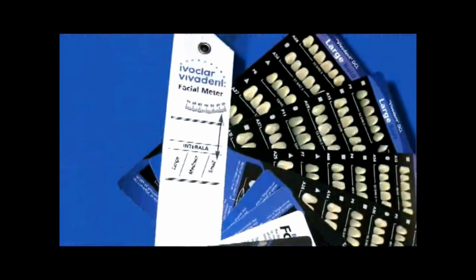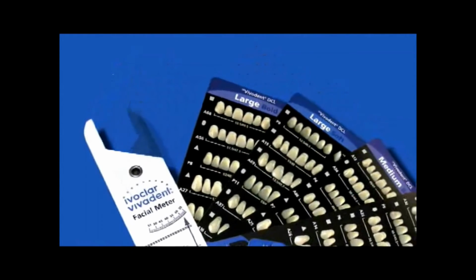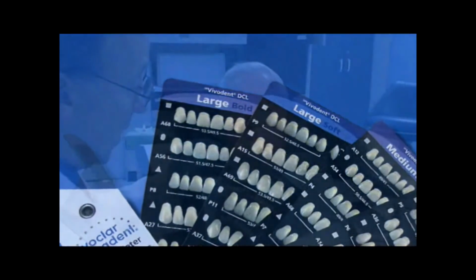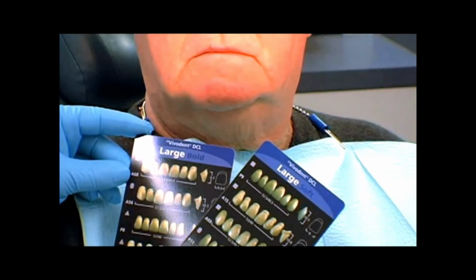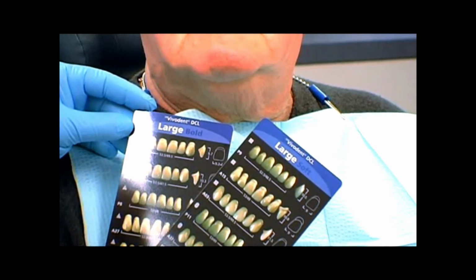Next, we unfold the tooth cards and expose the 2 cards of large molds. One card is composed of large, bold tooth molds, and the other large, soft molds. A decision is made whether a soft or bold design would be most appropriate for this patient. In this case, the bold card was selected.